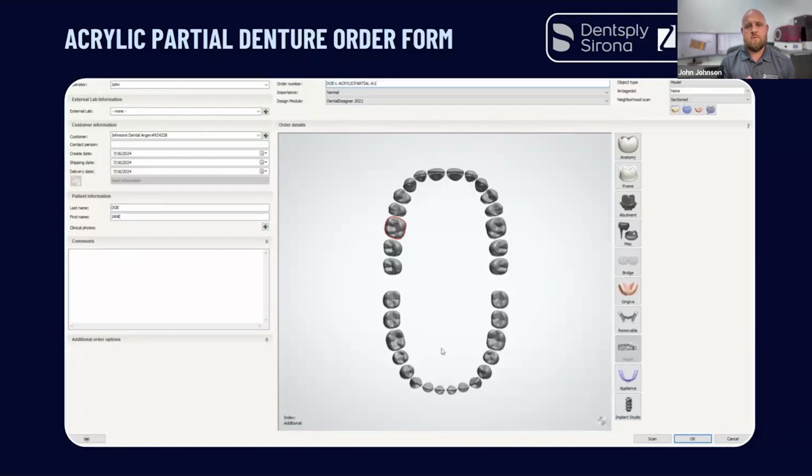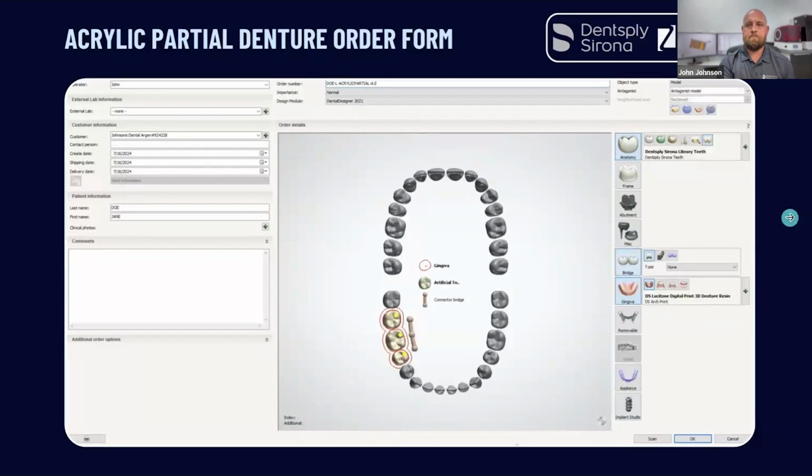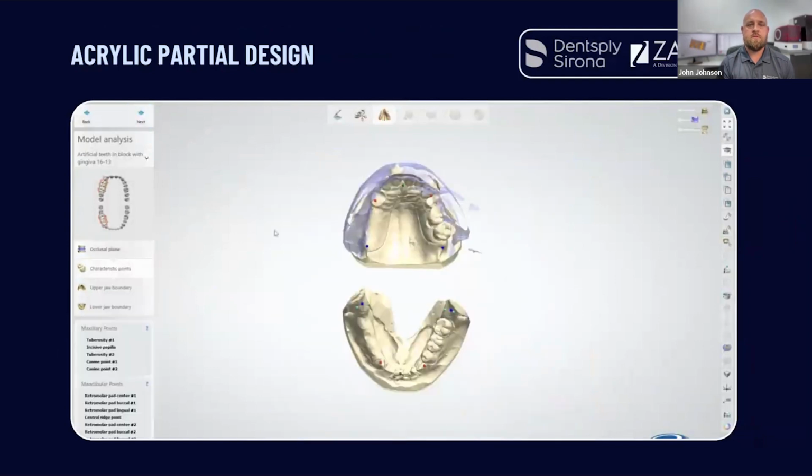Now, what you have to get a little bit creative with is how you want to bridge them. It's a little bit different than a denture, which is easy because it's quadrants. So if it's 3 teeth on the left, 1 or 2 teeth on the right, you have to decide which ones you'd like to bridge together for your final process. This particular case is just a single quadrant on the one side, so I bridge it there. And then I kind of just go through, and I believe it's going to work through.